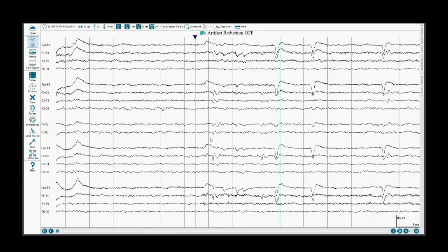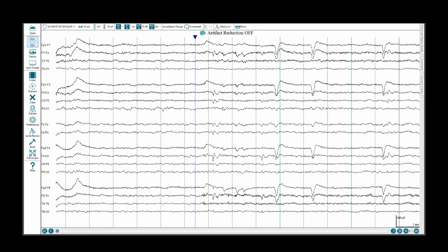Today we are going to look at a pediatric patient's EEG. The first thing we want to look at is this discharge right here. It has an odd polarity distribution. It does appear to be authentic, but the polarity almost seems perhaps nonsensical. Additionally, on this page we also see drowsiness for the first six seconds, and then we see two or three eye blinks towards the end of this epoch.